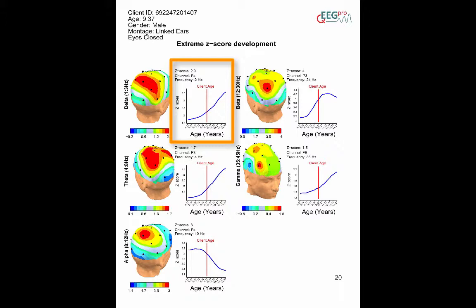Now suppose we compare the same power with younger and older age bins of the QEG Pro database. The resulting z-scores are plotted in a blue line. In the example, you can see that the z-score would be smaller if the client would have been younger and larger if the client would have been older.